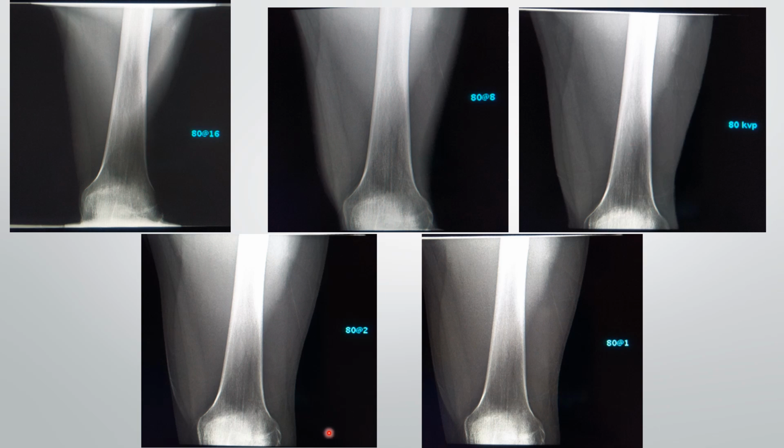But as we go down, we can really see the skin well represented, okay? And this is only changing the quantity, okay? The penetration of the beam is staying the same through here, okay? It's just because there's more x-rays reaching the IR because we're producing more as we're changing the mAs, that it's representing it more and more dark on the final image, okay?